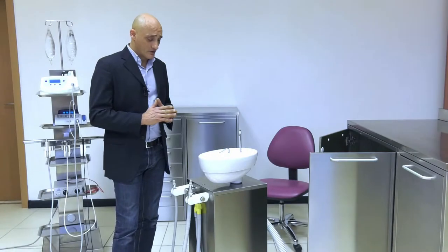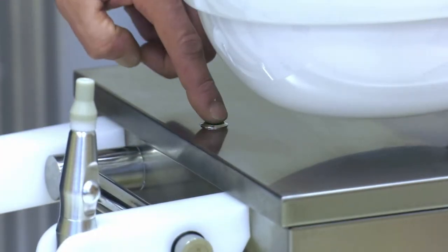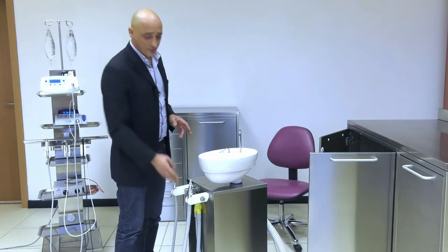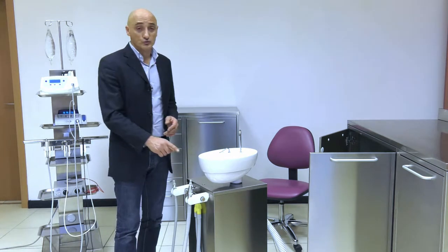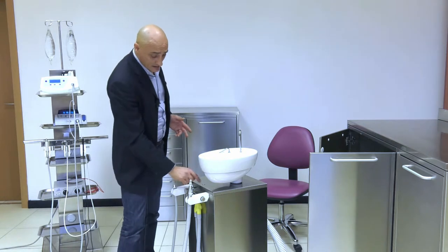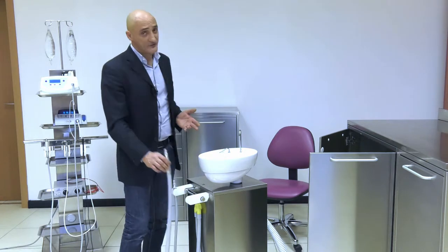We deliberately decided to include this button to turn on the suction, as you have the option of leaving the cannula on its support. Indeed, with a sterilizable rubber tube that we insert in the patient's mouth, you can press the button to activate suction, which is not possible if you have to lift the cannula to perform the operation.